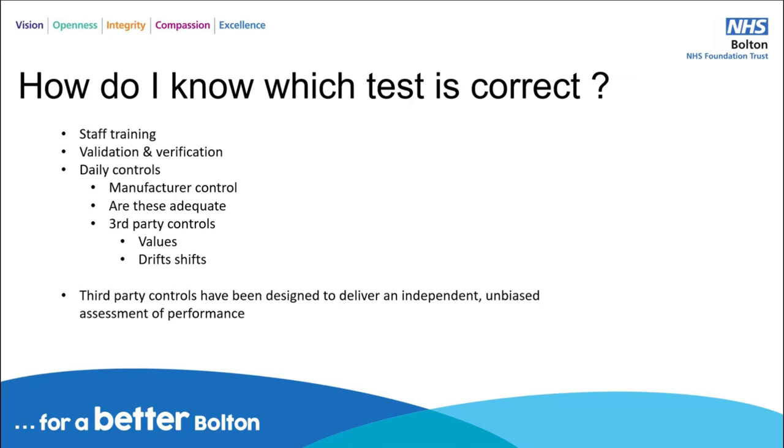And then we would discuss the third party controls as well, looking at values, the specific values around clinical decisions in the grey areas, just below and above the cutoff, and explain that there hasn't been any drift or shifts in the testing over a period of time. So that gives that individual, and gives us, the confidence to know how a test and a platform is performing over a period of time, not just on that particular day.